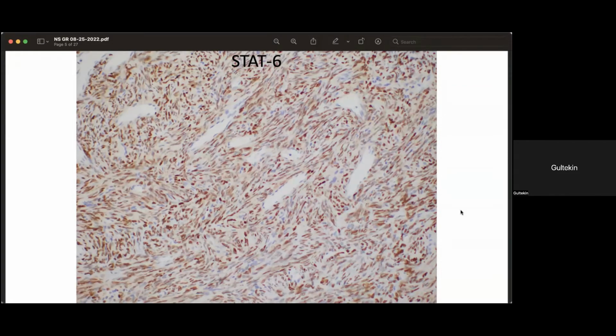We have an immunohistochemical stain now that shows this as a nuclear labeling. So this STAT6 marker is recent and actually revolutionized the specific diagnosis of the solitary fibrous tumor hemangiopericytoma spectrum, because when it's positive, we have this tumor. There is no discussion. You don't see this STAT6 positivity in meningiomas or other mesenchymal or soft tissue type tumors that may mimic hemangiopericytoma.